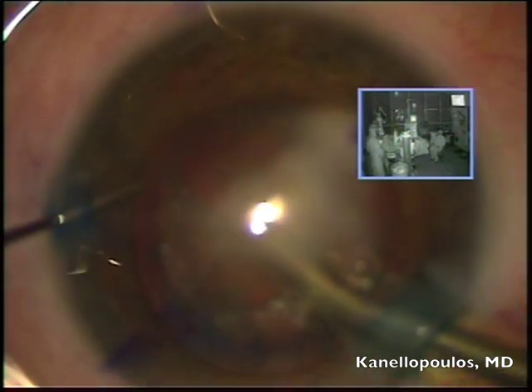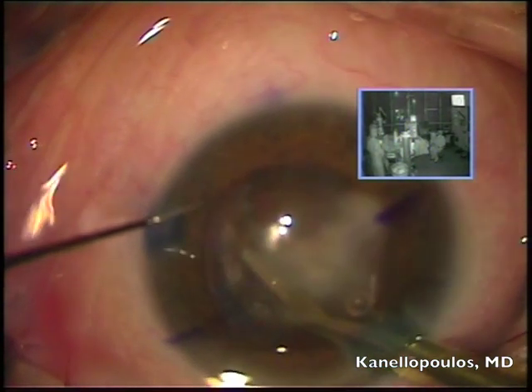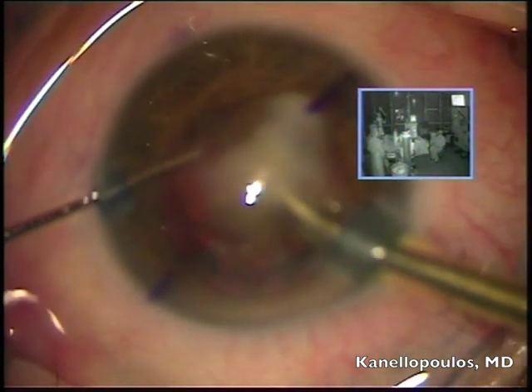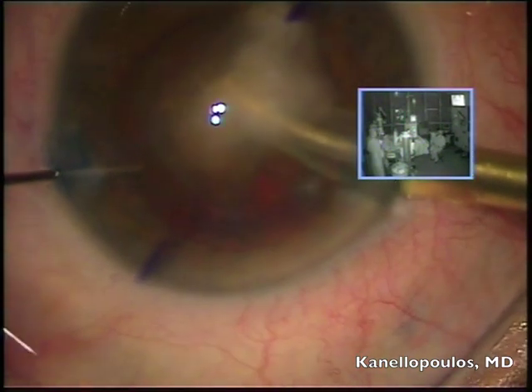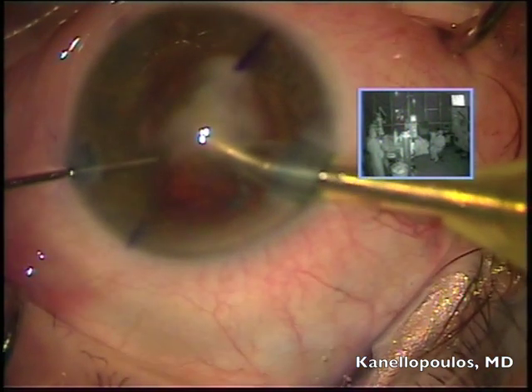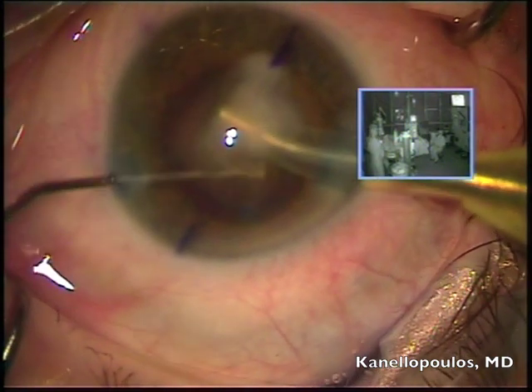My ideal approach to this patient would have been to laser first to reduce that scar, because we saw there's at least 500 microns of thickness, and then proceed with the cataract procedure to also adjust for the possible refractive change that scar reduction with phototherapeutic keratectomy would have produced. Of course, a penetrating graft combined with a cataract procedure is another option.